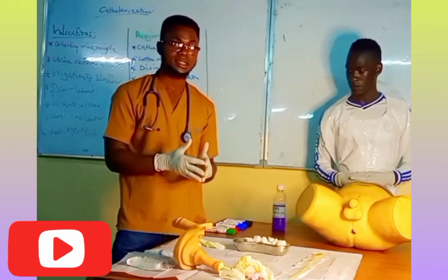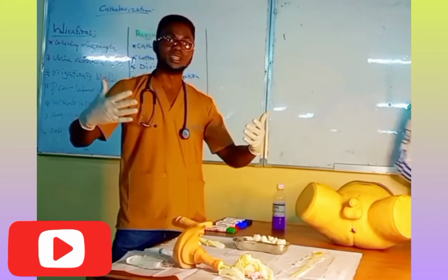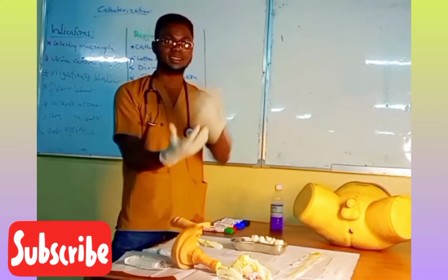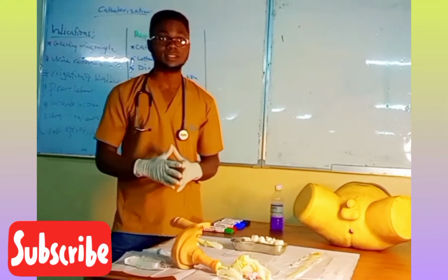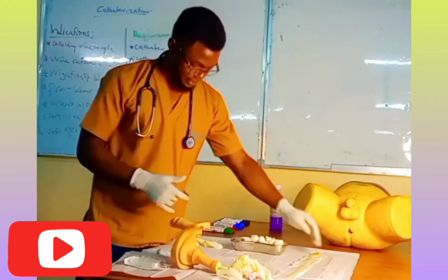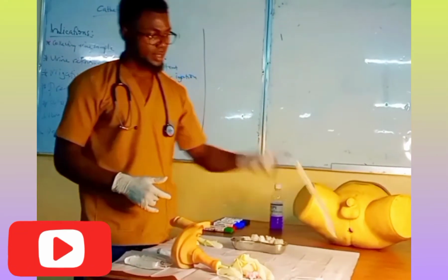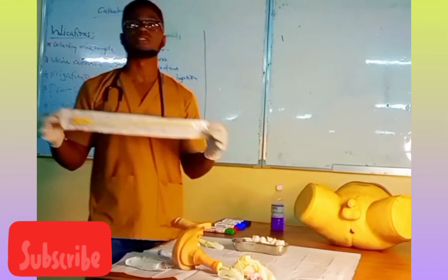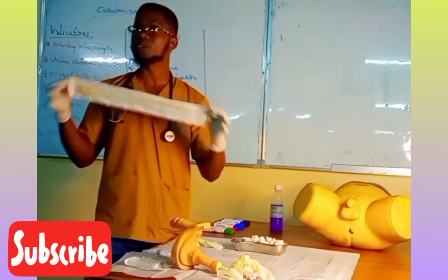These ones are just disposable examination gloves, but on top of them I need to put sterile surgical gloves. Another thing: as I'm putting on the gloves, this pack is enclosed twice, sealed twice.